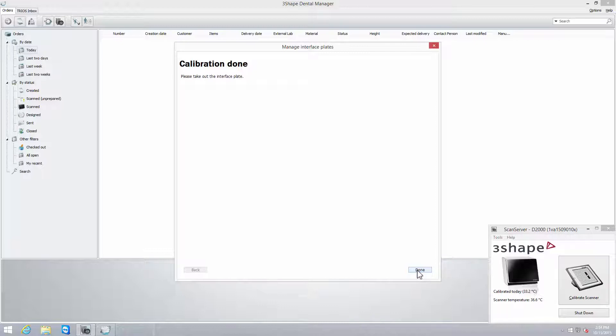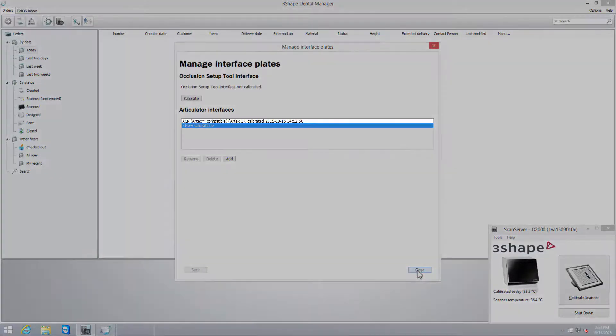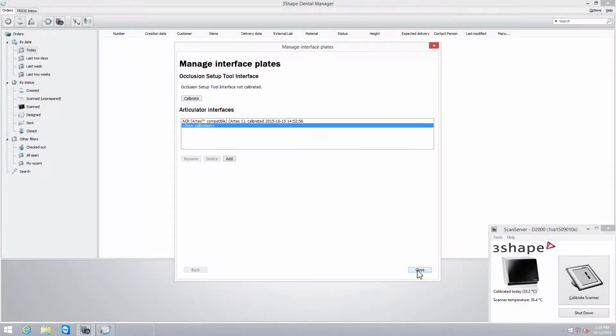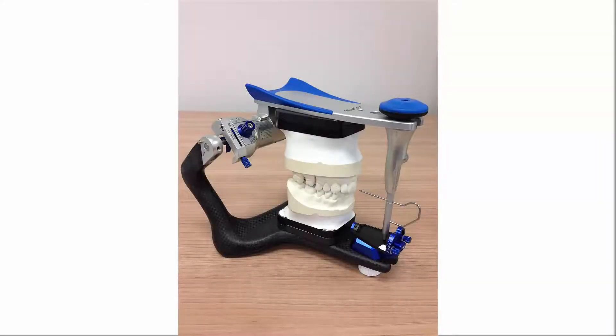After calibration has finished, the transfer plates for that articulator are added to the list. The transfer of the position of the mounted models from the physical articulator to the virtual one has now been calibrated. And models mounted in the articulator can now be scanned.